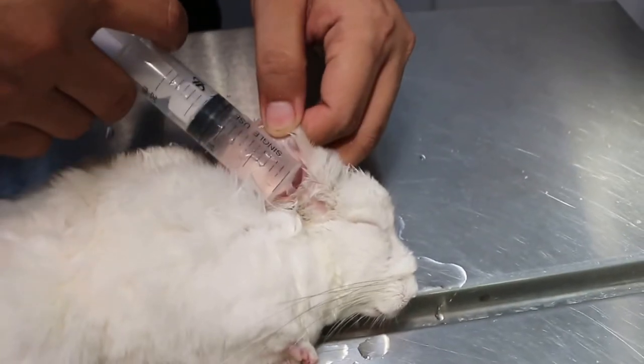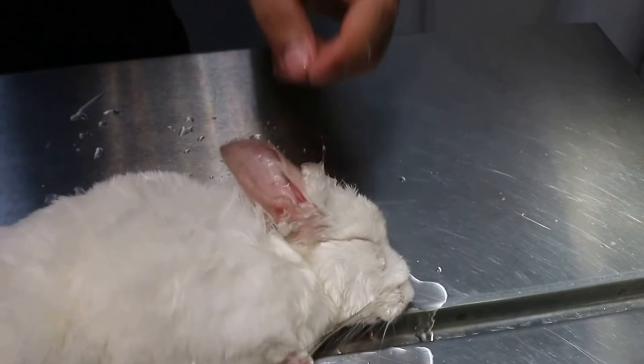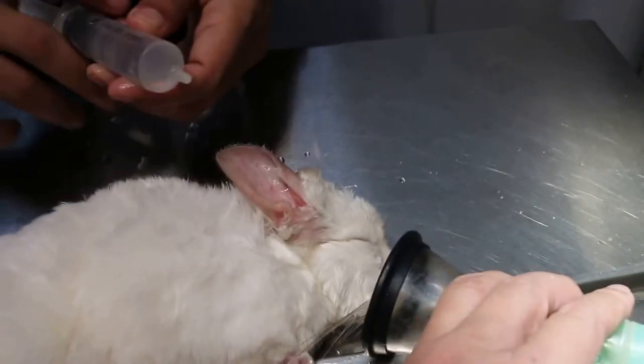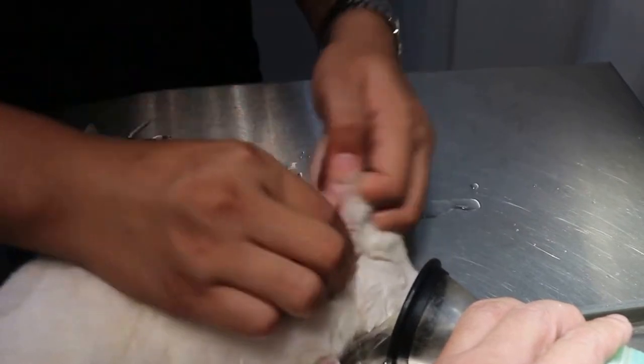It's sleeping, you can see. 2 times is enough — just dilute the chemical. Then the whole ear, middle ear, are rubbed.